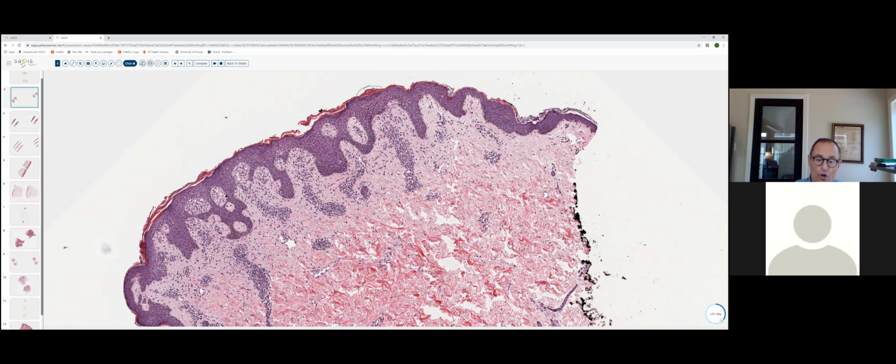That being said, we can distinguish something like this from mycosis fungoides, where you would expect to see more atypical mononuclear cells and pronounced epidermotropism, and, as we've been discussing, from guttate psoriasis or psoriasis, in which you would see more thinning of the suprapapillary plates, more dilated vessels, more pronounced parakeratosis, and a lot of times neutrophils at the summits of parakeratotic foci, which again are devoid of serum. So hopefully that helps someone.